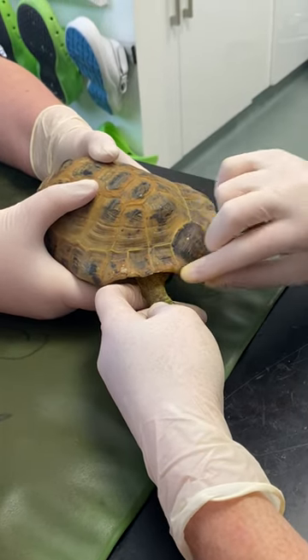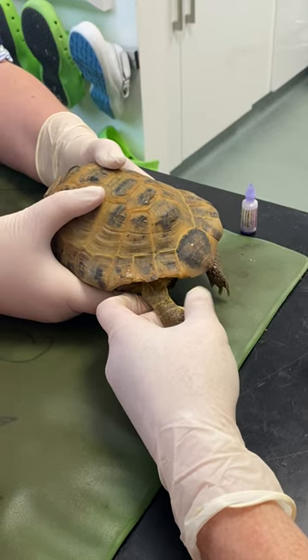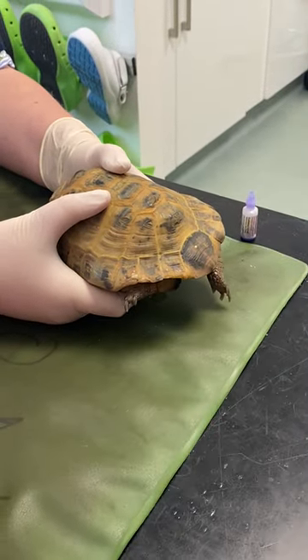Sometimes you put a little bit more glue on than expected, and the tortoise shoots their leg inside — and they will glue their leg shut inside themselves. So just hold it until it's finger dry, and that's it, all done.